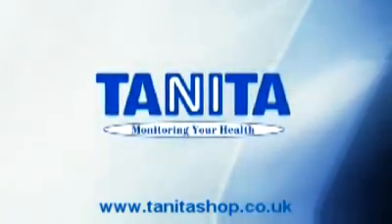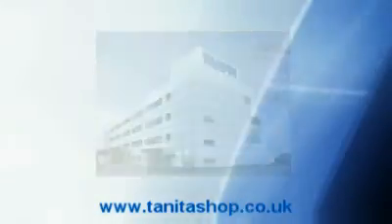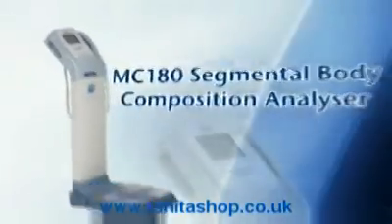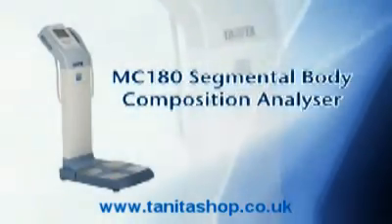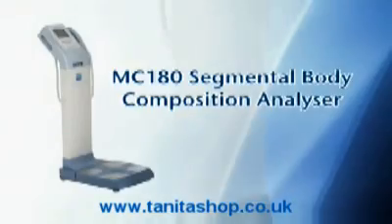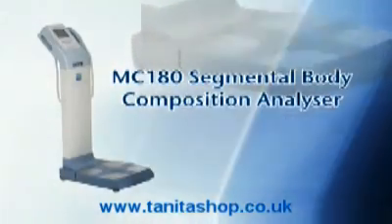Tanita, the leader in precision weighing and BIA analysis, brings you the next generation in body composition analysis using the latest multi-frequency technology. The MC180 Segmental Body Composition Analyzer has been specifically designed for professionals requiring reliable and repeatable body composition results in seconds.